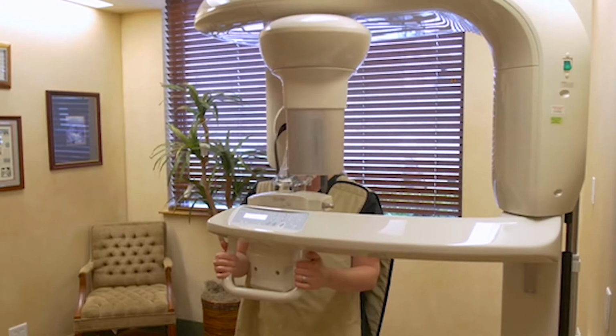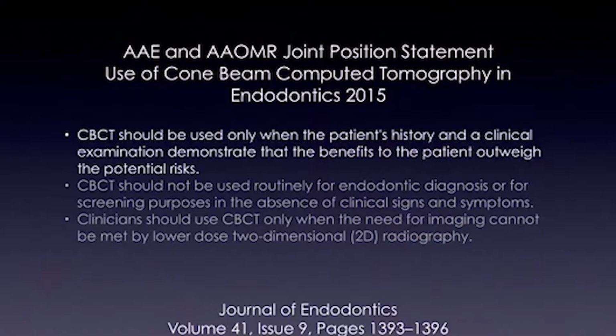Regarding the importance of this technology, the American Association of Endodontists and the American Academy of Oral and Maxillofacial Radiology issued a joint position statement on when CBCT should be employed. This paper starts out by telling us when CBCT should not be used. It said CBCT should only be used if the patient's history and clinical examination demonstrate that the benefit to the patient outweighs the potential risks.